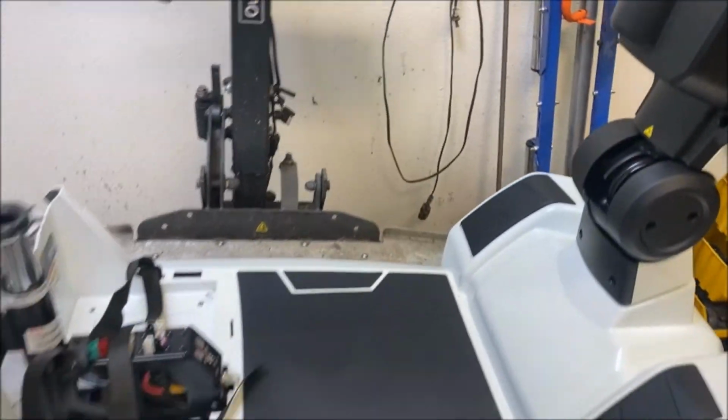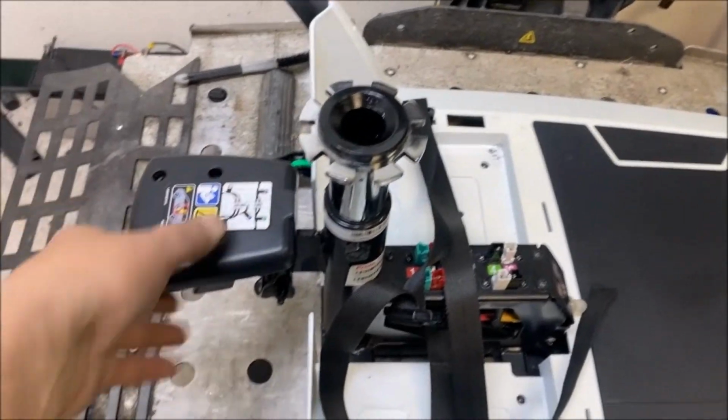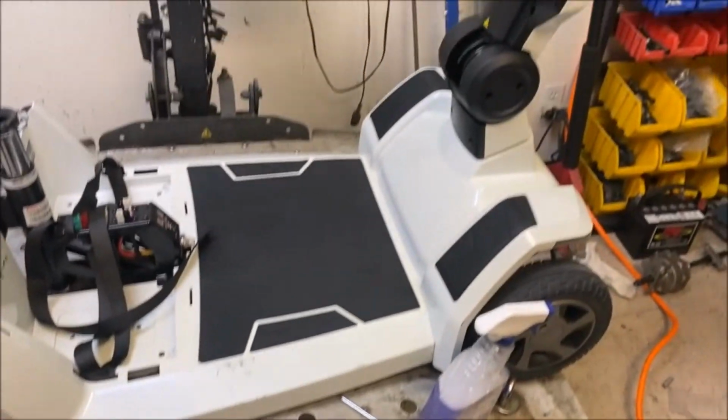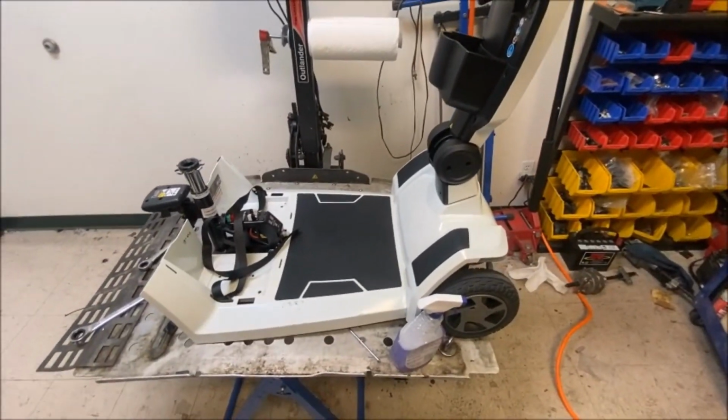Just got to tighten these up. I don't think these are loose anyway, just to go over them. There's a couple, like I said, a couple of loose screws there, nothing to worry about. Put grease on everything that needs it, including the seat post and the release mechanism. So that's all done, and I'll give it a once over when it's back together. Give it a good polish.